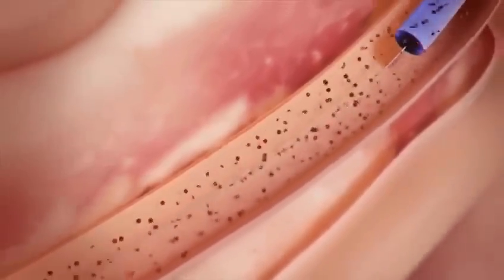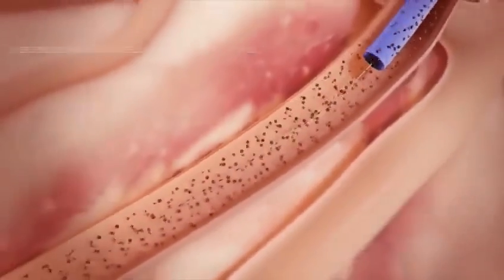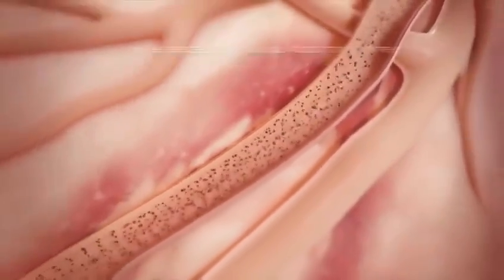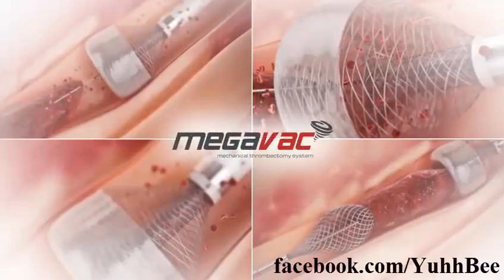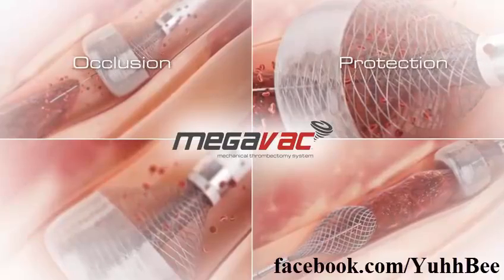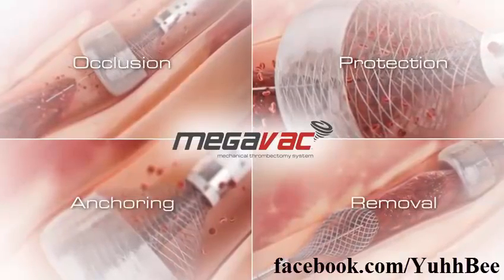Rapid removal of occlusive thrombus with vacuum extraction can accelerate door-to-balloon time and improve outcomes. A four-feature solution in one device: occlusion, protection, anchoring, and removal.